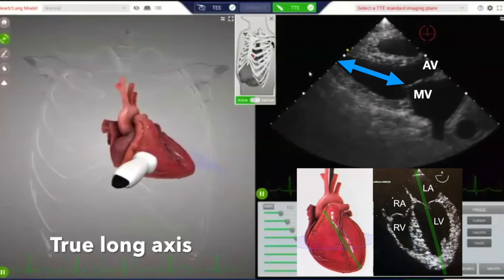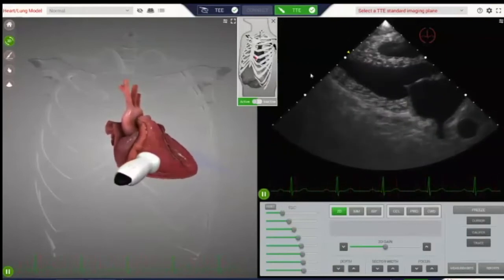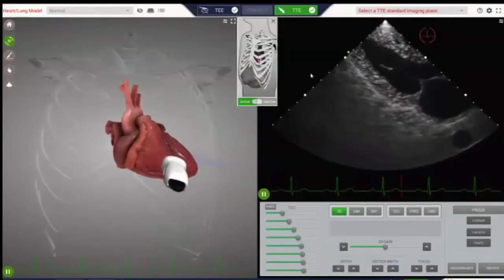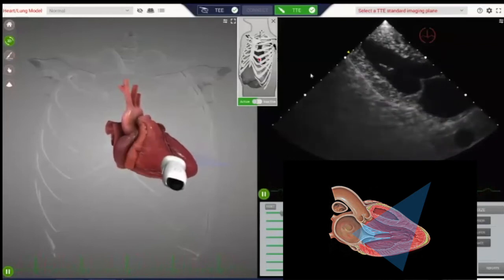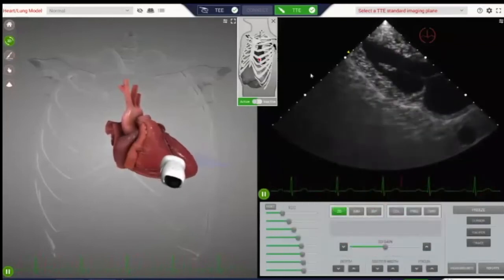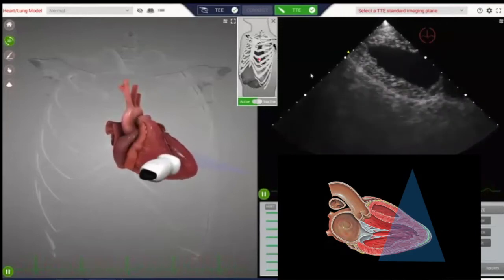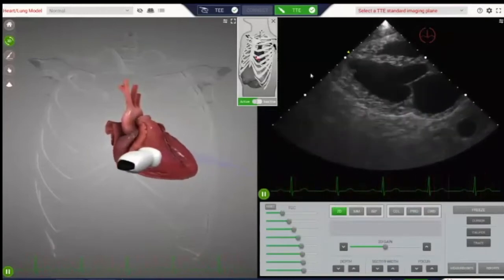You know you're in the LV long axis when you can see both mitral and aortic valves, and the LV looks maximally stretched. Sometimes the LV can appear to point to the top left of the screen — this is because the probe is a little more lateral along the long axis than it should be. To fix this, angle the probe towards the apex so the LV appears more horizontal, then slide medially to visualize more of the base of the heart.